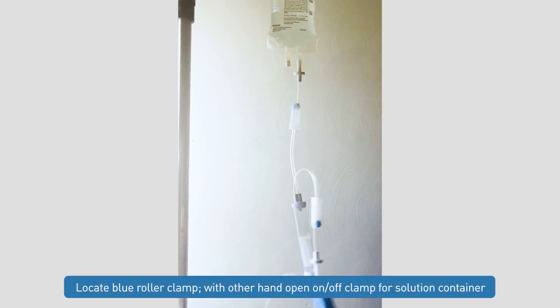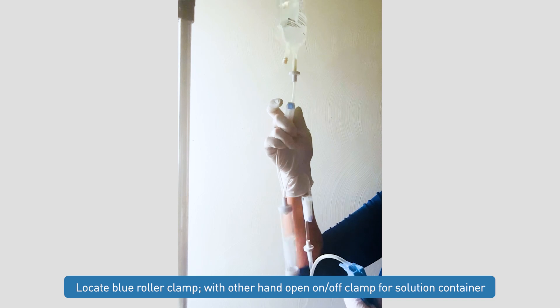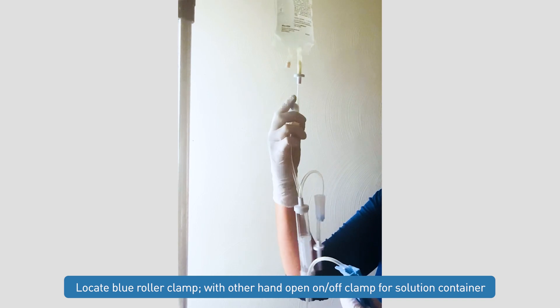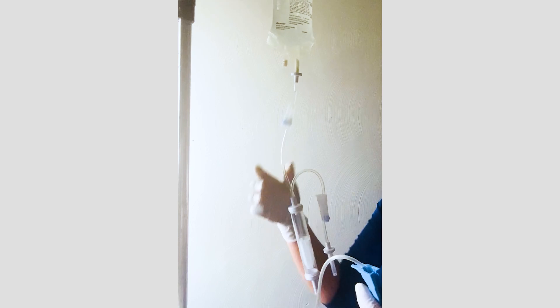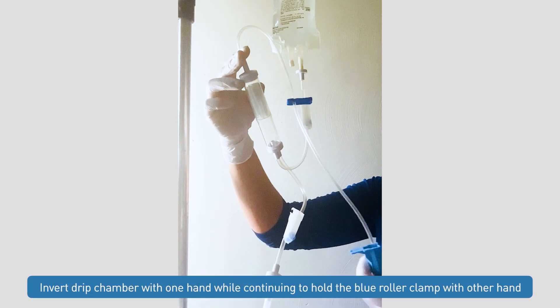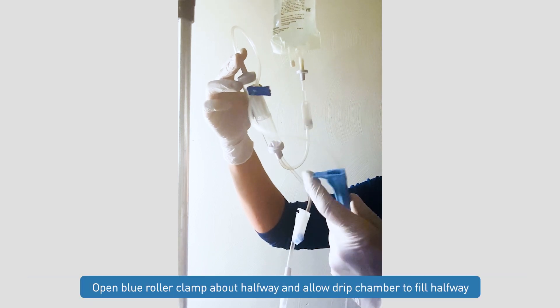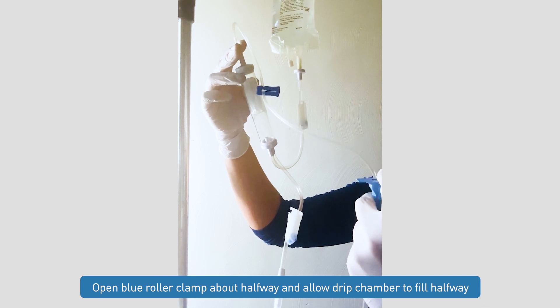At this point, we will locate our blue roller clamp and go ahead and open our on-off clamp for our solution container. We're going to invert our drip chamber upside down. Using our blue roller clamp, we'll open it about halfway and allow this drip chamber to fill about halfway.